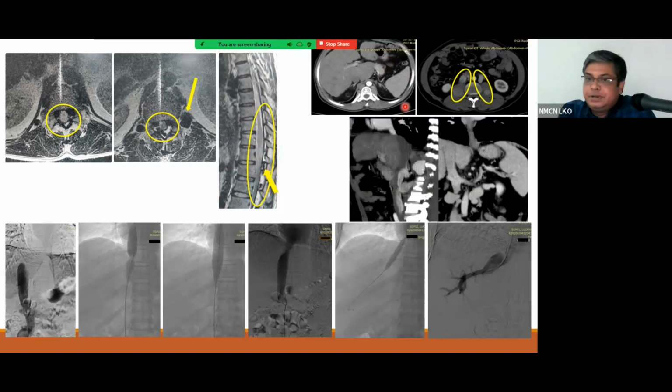We could retrieve only limited CT data of this patient. Here on these axial CT images, we can see caudate lobe hypertrophy with a nodular liver surface, suggestive of CLD. And we can see large paravertebral collaterals, with collaterals also extending into and indenting the psoas muscle. Here on these reformatted images, this is actually not venous, this is a late arterial phase.